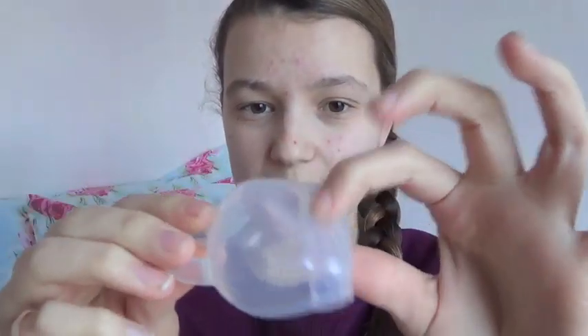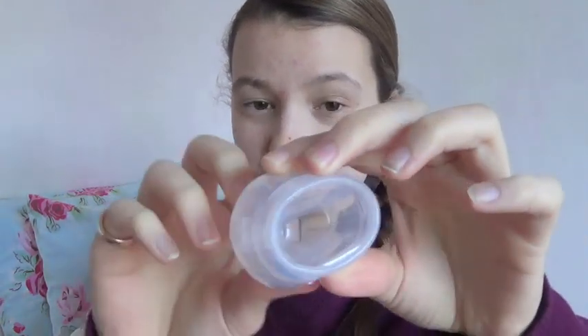It didn't hurt me because this material is pretty soft. It's firmer around the rim to allow the cup to open up, but down here it's pretty soft and easy to grab, so that might be a plus if you want to pull the cup out easily. It definitely didn't hurt my urethra. I did have to do the fold where you press this down and bring the lips around, but I did manage to get it out pain-free.